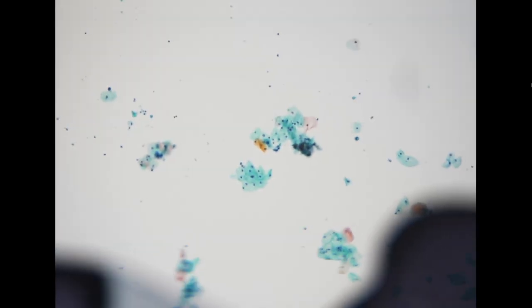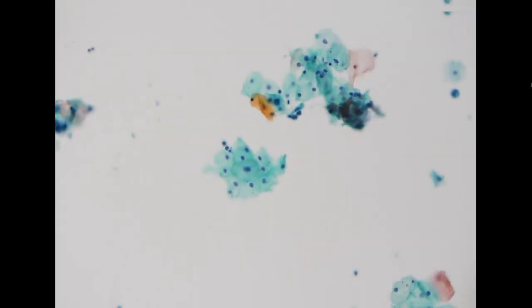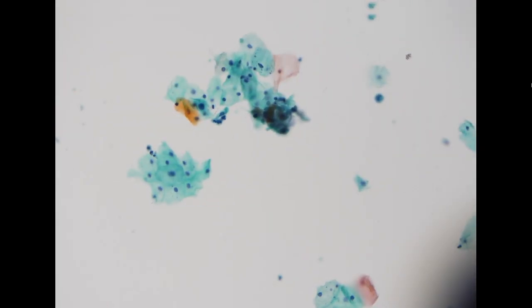So for the current Paris System, the main purpose is to reduce the rate of atypical cases and to increase the diagnostic rate for high-grade urothelial carcinoma. So for this case, in the clinical history, we already know that the patient has a history of urinary bladder stone.